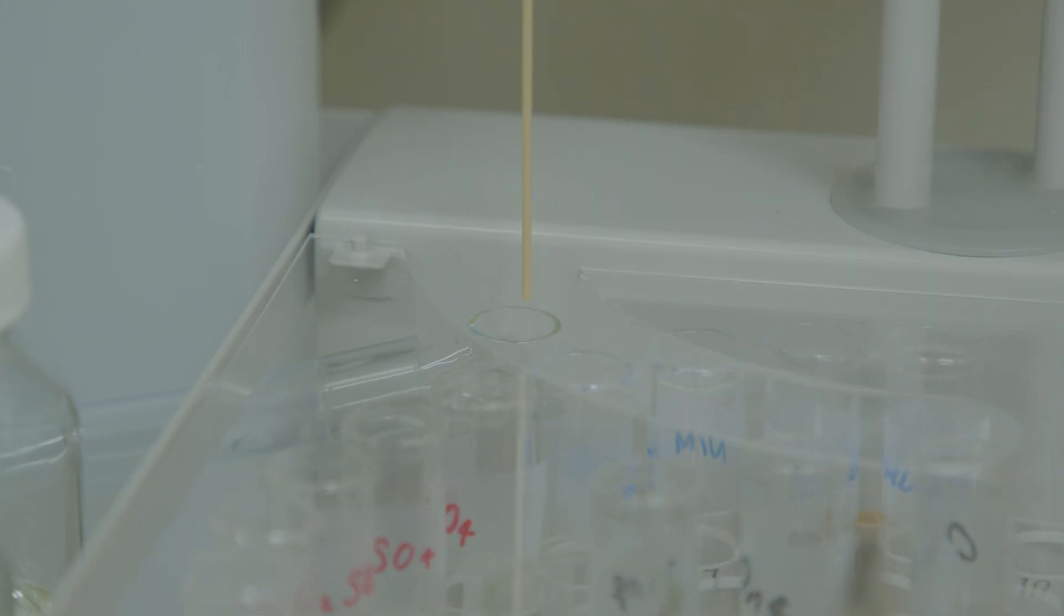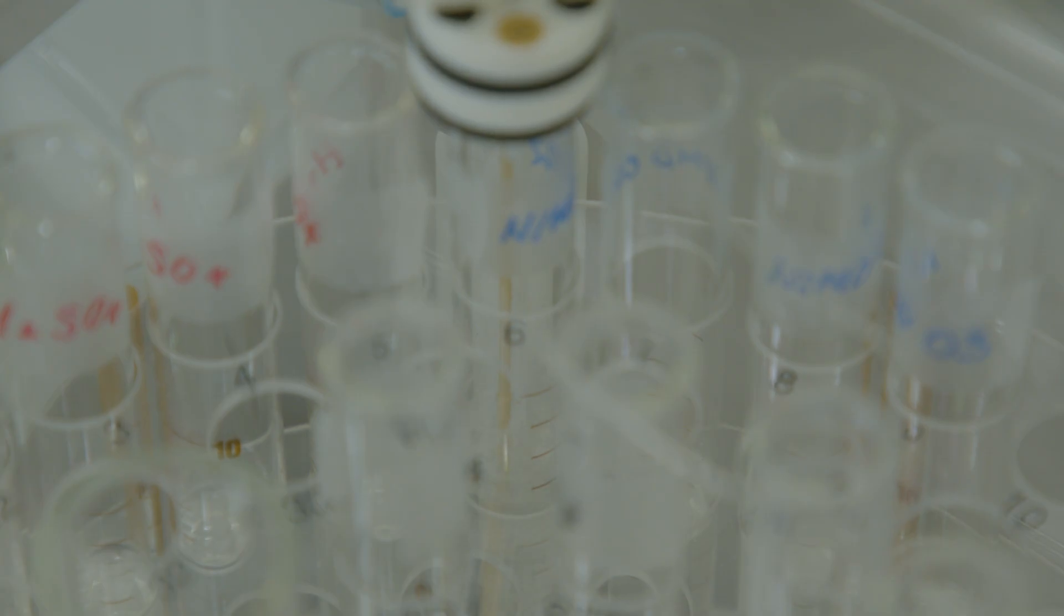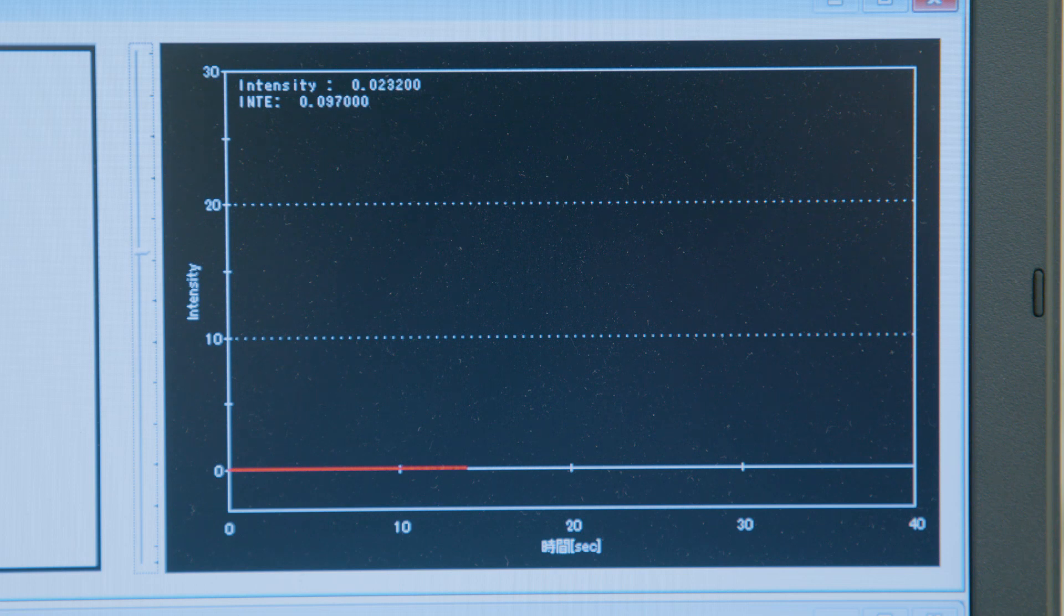To ensure accuracy, it is good practice to verify our analyses regularly by analyzing a CRM sample, such as with TDAAS. Remember to prepare a sufficient quantity of the pre-treated CRM solution in advance.